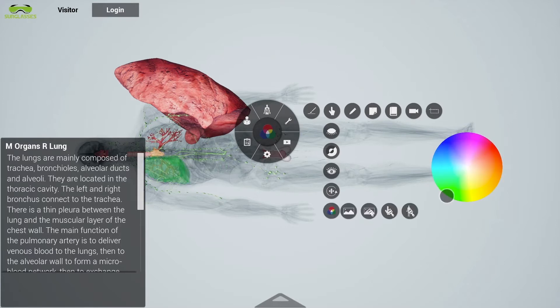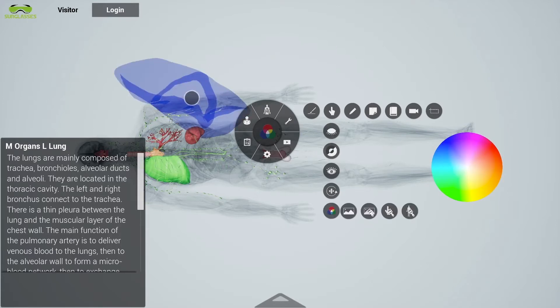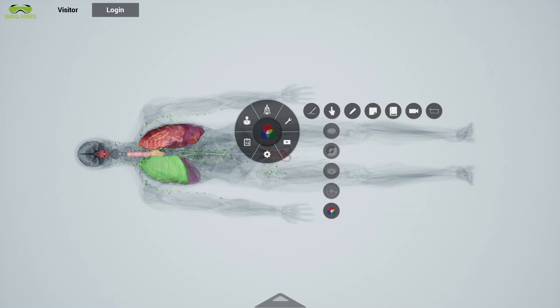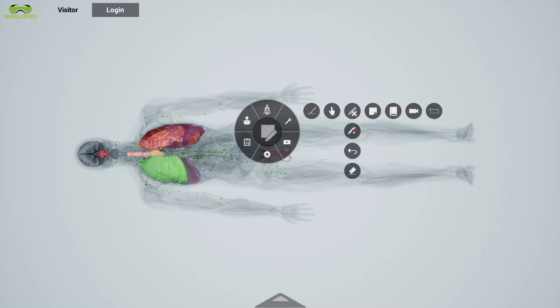Asclepius is a fully annotated anatomy atlas that provides the details of any organ touched on the virtual human cadaver, whether male or female, as seen on the lower-left corner of the screen.